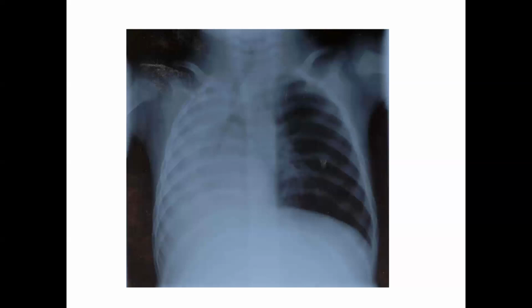Fluoroscopy is a moving X-ray, so you might see someone going for a swallow study or something to that effect, do something under fluoroscopy, or sometimes they may place lines under fluoroscopy if they're going to put an intra-aortic balloon pump or a stent for a patient that's coming in for percutaneous coronary intervention, PCI. Those individuals a lot of times will undergo the procedure under fluoroscopy.